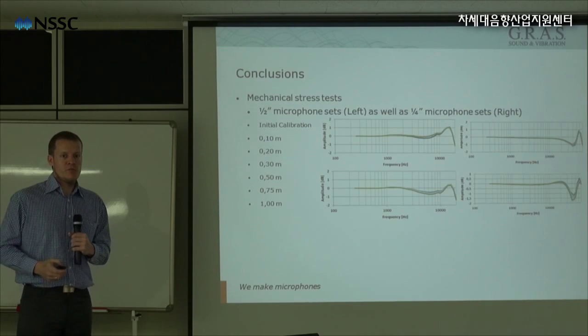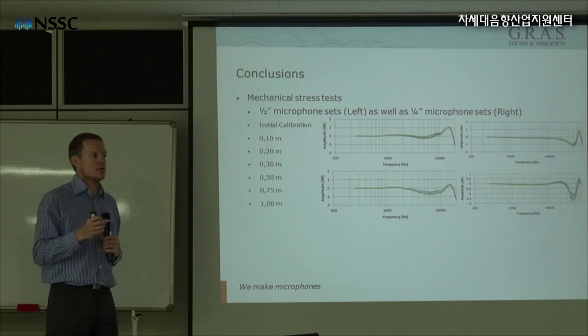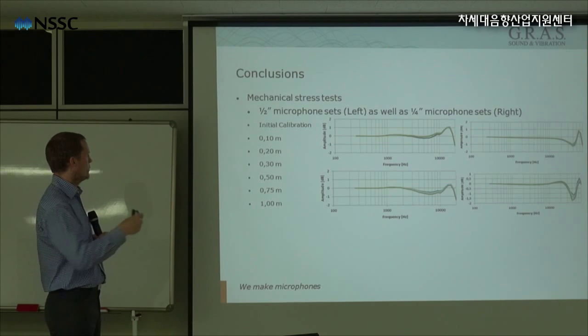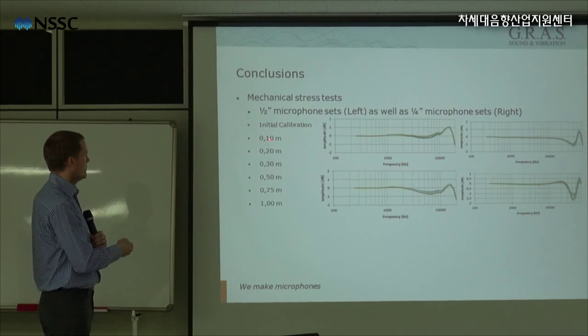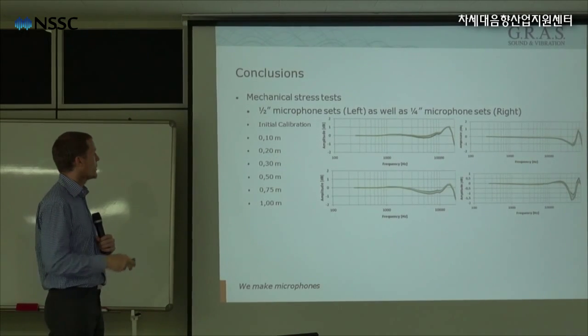So what we saw in the movie was the setup that we are using at G.R.A.S to do the drop testing. We have this fixture that we can set for 10 centimeters, 20, 30 and up to 1 meter. And then we do the drop testing.